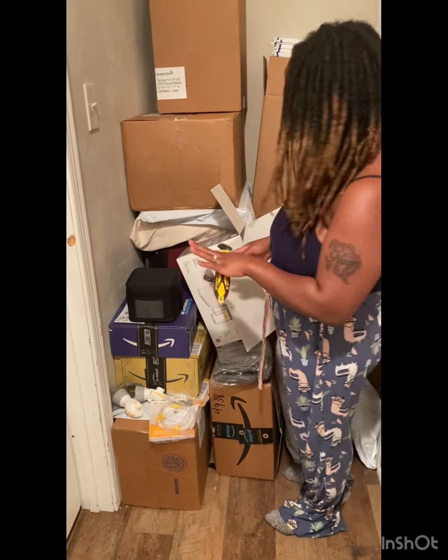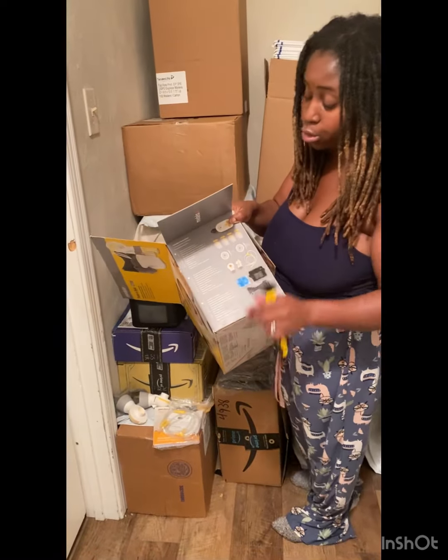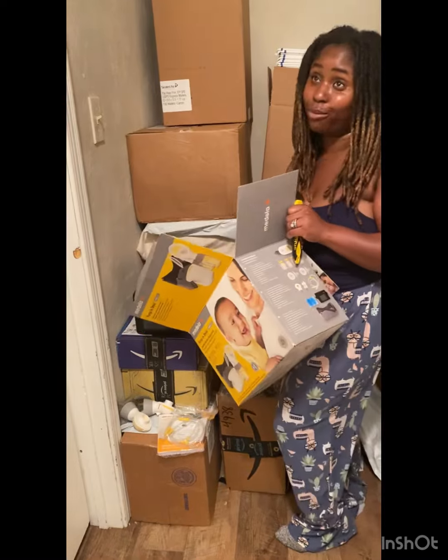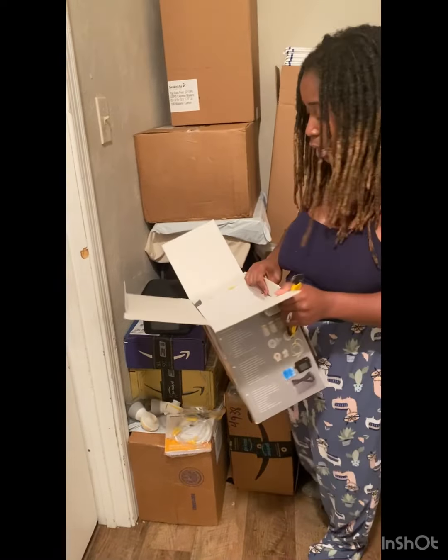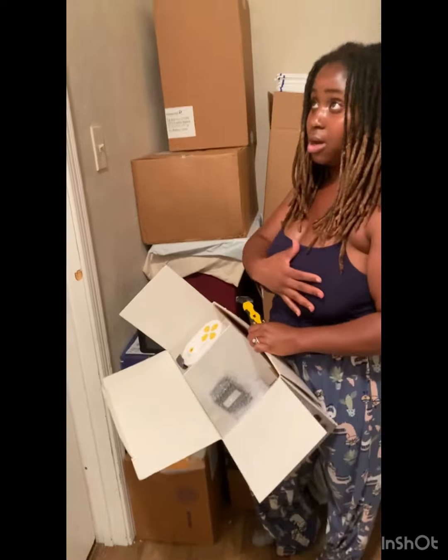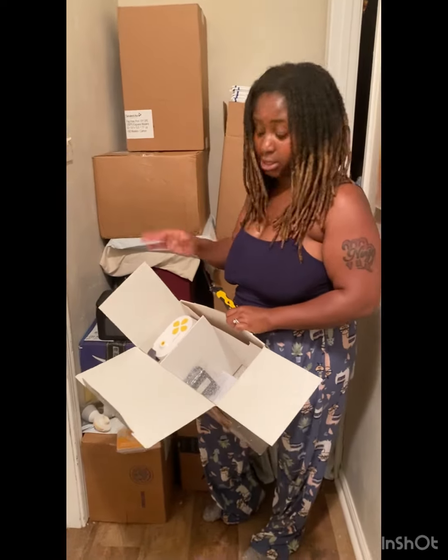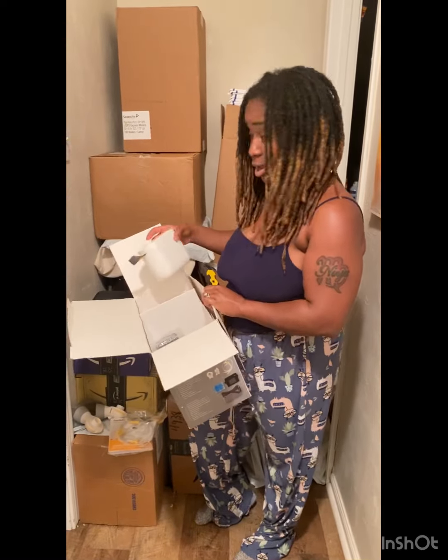Y'all, this is worth the price, by the way. I bought this on Amazon. It was on sale. It's originally $200 and some dollars, but I think it was like 55% off. And this was like the height of the formula shortage slash recall. So they had a big sale with all of the breastfeeding items, the breast pump items. They had a big sale with the pumps and also the pumping bras. I hate that y'all missed out.